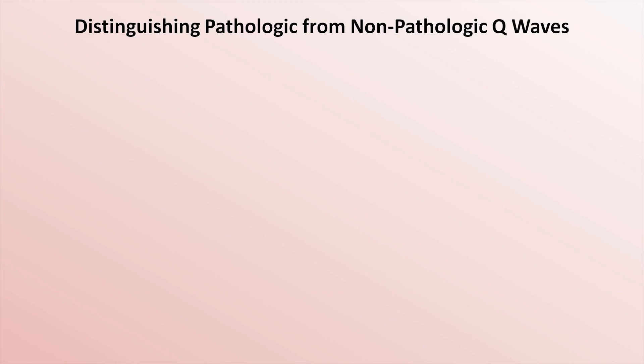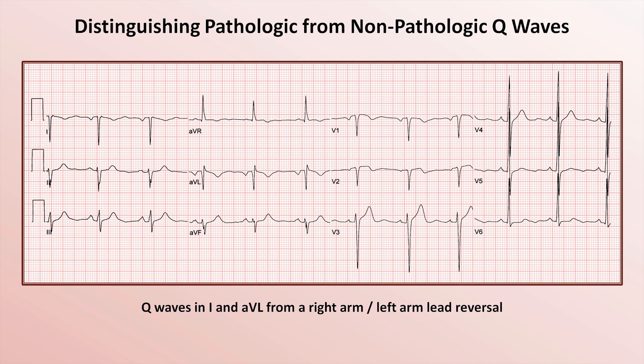In this EKG, there are pathologic Q-waves in leads 1 and AVL, which are not the consequence of true cardiac pathology but rather the consequence of the right arm and left arm wires being accidentally switched by the person recording the EKG.